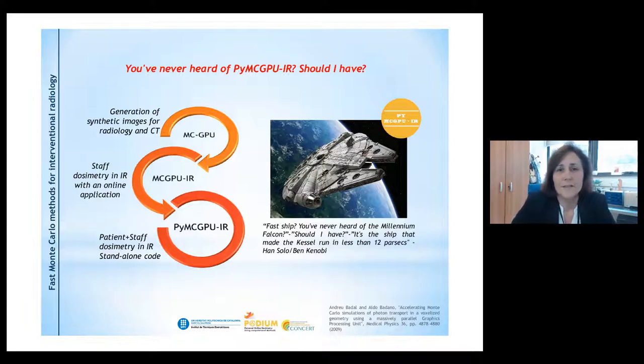Well, this code is based on MCGPU. This MCGPU was developed by Andreu Badal at the Food and Drug Administration of the United States many years ago. It's written in CUDA and runs on GPUs. It means that the system can calculate things in a very fast way. But in principle, this code is designed to provide synthetic images for radiology and computed tomography.